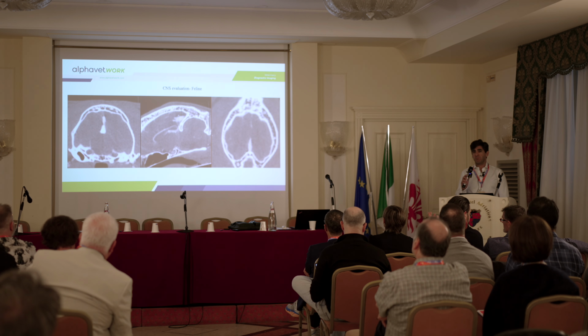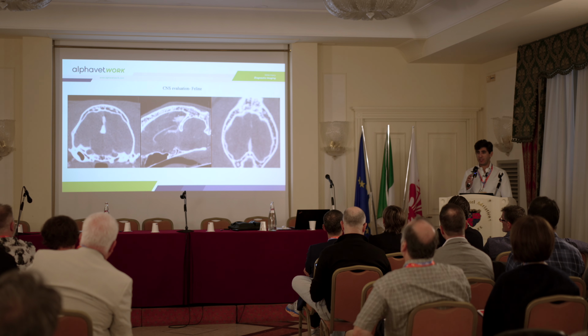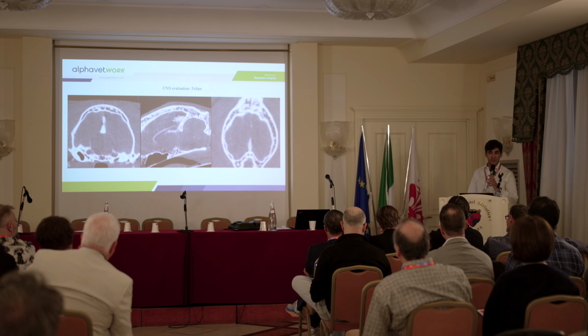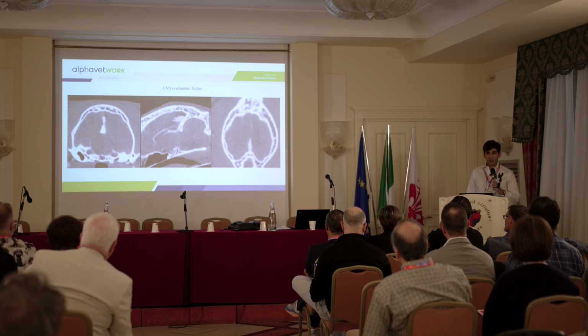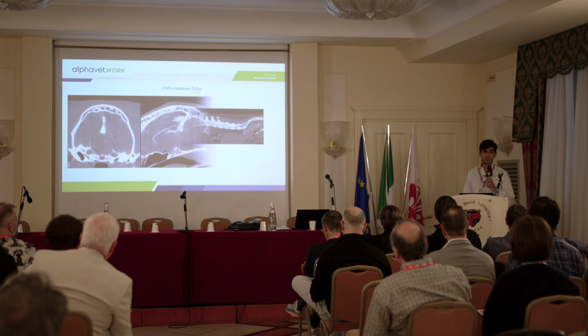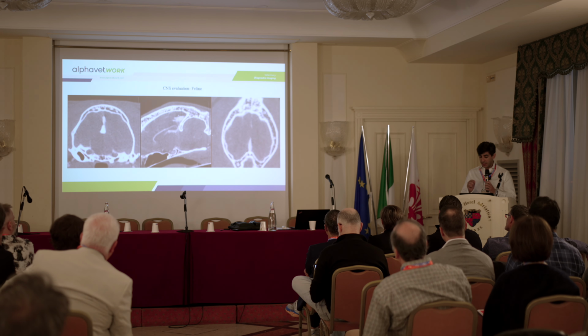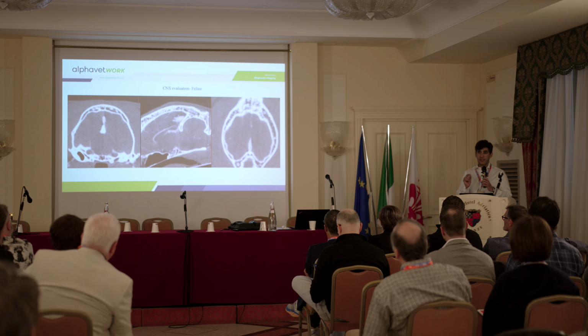The cat was not feeling well, so the colleague from Cyprus did a CT, and I told him, nice, you saw that you have an early meningioma. It's so tiny. If you go fast in a CT with a feline patient, in my opinion, you could miss it. And also in the CBCT, you have to be very focused. But this is very nice, and I'm happy that we can demonstrate that we have cases like this.